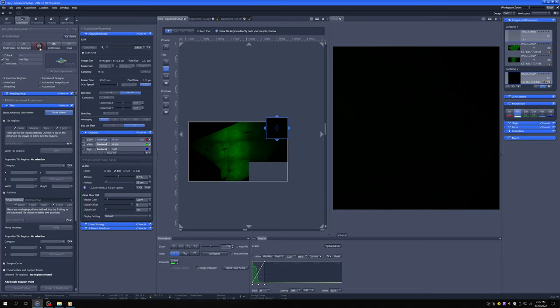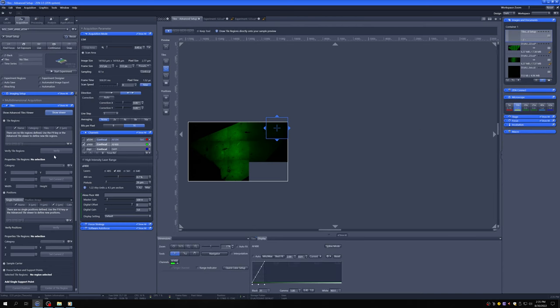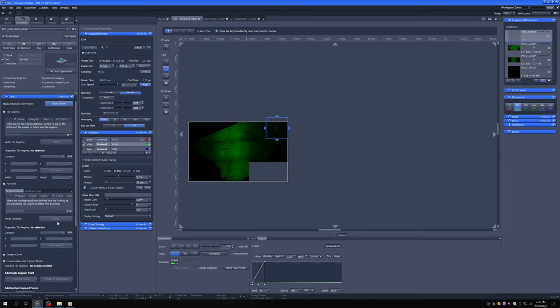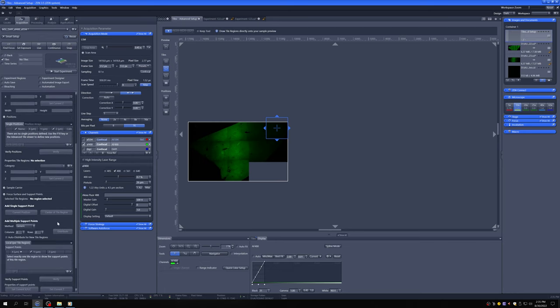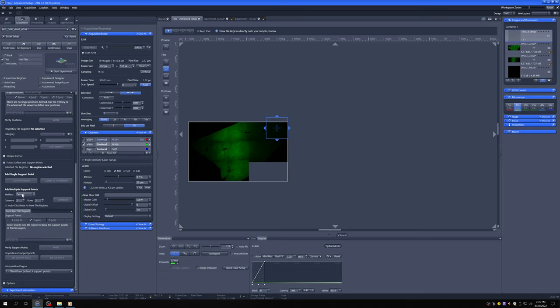The way you do it is in tiles, you go here and you open this option called focus surface and support points. There are different ways of doing this. In the simplest way, you're going to add multiple support points using a generic method. This works well with a tilted slide. It doesn't work well if you have a sample that's kind of wobbly, and that can happen if you have a section that's folded in on itself. But for the case of tilted, you can use this generic method.